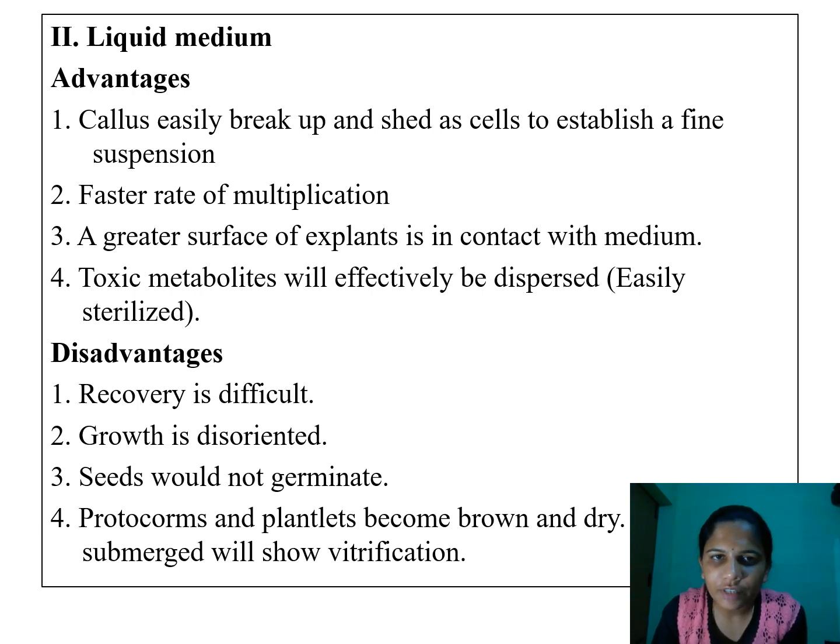Next one is liquid medium. Liquid medium is normally used for callus formation or callus culture. Here the callus easily breaks and it will establish very fast. So the multiplication rate will be more, and the surface area of the explant and contact will be more. The disadvantage you have seen in solidified media, where the explant does not have much contact with the medium, can be avoided using liquid medium.